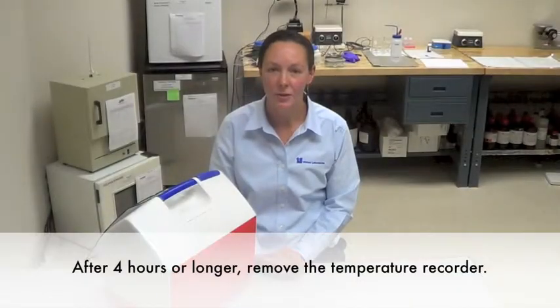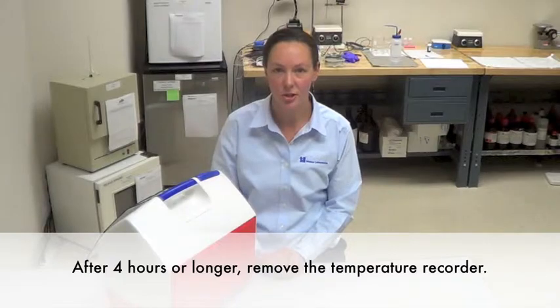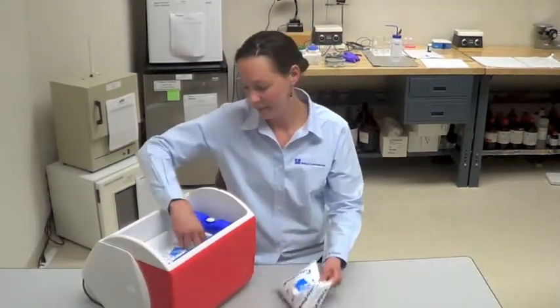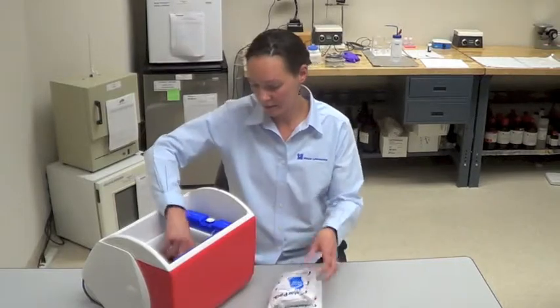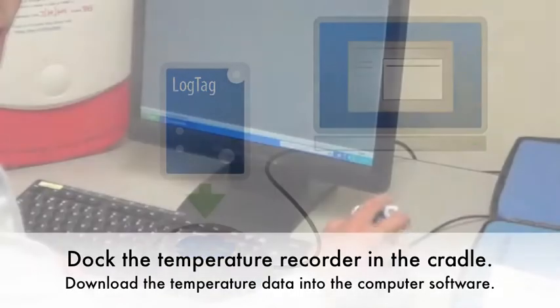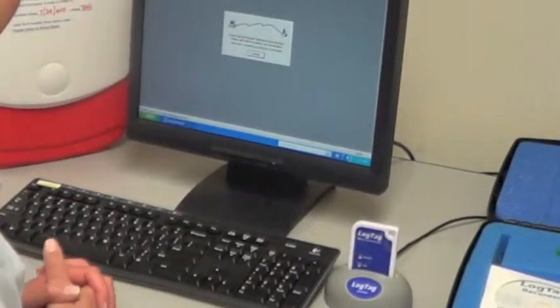At the end of four hours, or whatever time you determined to perform the validation procedure, you'll remove the temperature recorder. Take out your cold packs, your simulated blood, and then you'll dock the temperature recorder in the cradle to download the temperature information onto the computer.